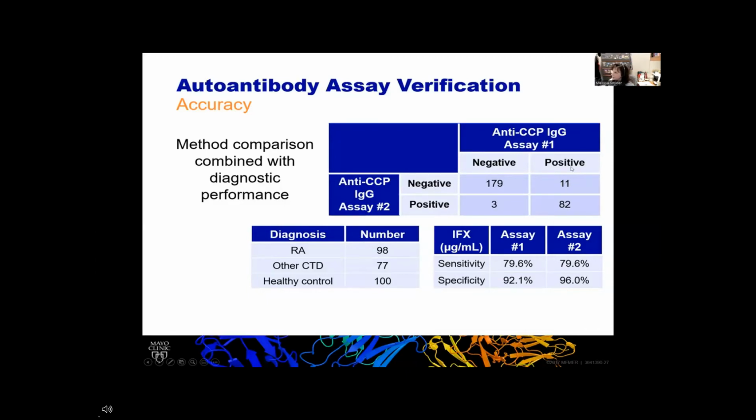Now, does that necessarily prove that these are false positive results, or at least analytical false positives? I would say no, because these individuals still may have the autoantibody. It's just that they don't have clinically apparent rheumatoid arthritis. They haven't been diagnosed at this particular point yet.